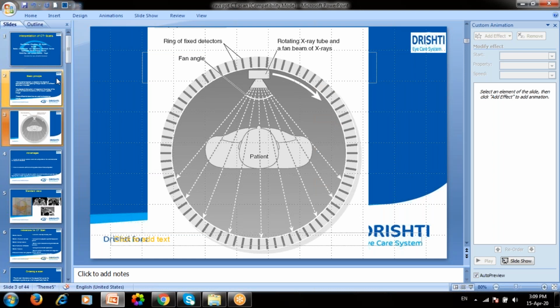Okay, so as you know, to be an ocularist, you need to know about oculoplasty, right? Oculoplasty means the orbital thing. If you know about the orbit, then only you can be a good ocularist. Sometimes it is a normal case with the eyeball. Sometimes I have seen many cases where I fitted a prosthesis two months before, and after six months the patient comes saying the prosthesis came out, not fitting well. In six months, I don't think there will be very much difference in the socket.